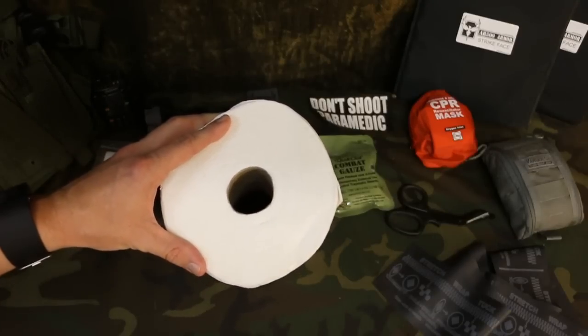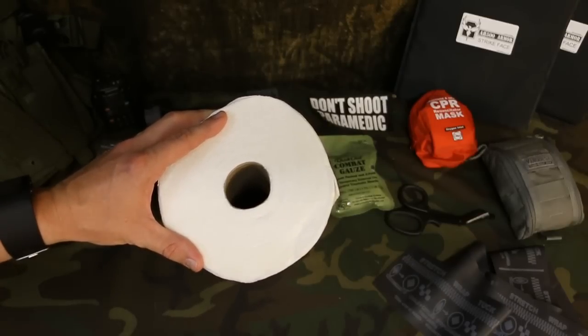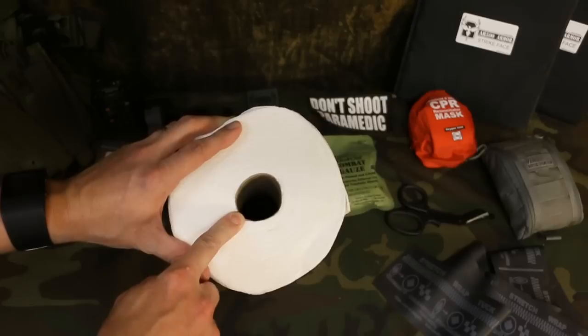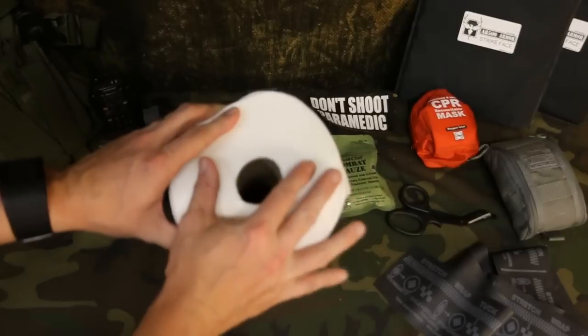Before I go through and show you the SWAT-T tourniquet, I just want to give you a quick refresher on exactly what we're doing with a tourniquet when we apply it. I've done videos of this in the past and I will put a link to the annotation, but this is just going to be a quick refresher. So here is our artery. It's a high pressure system, pumping blood out at high pressure, flowing like crazy, squirting bright red blood.